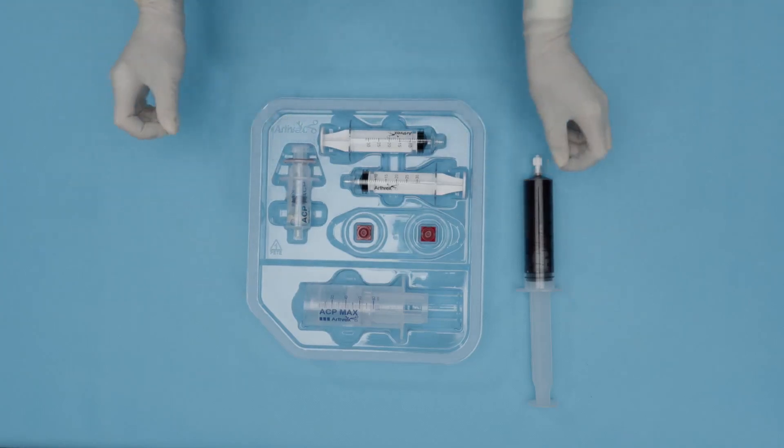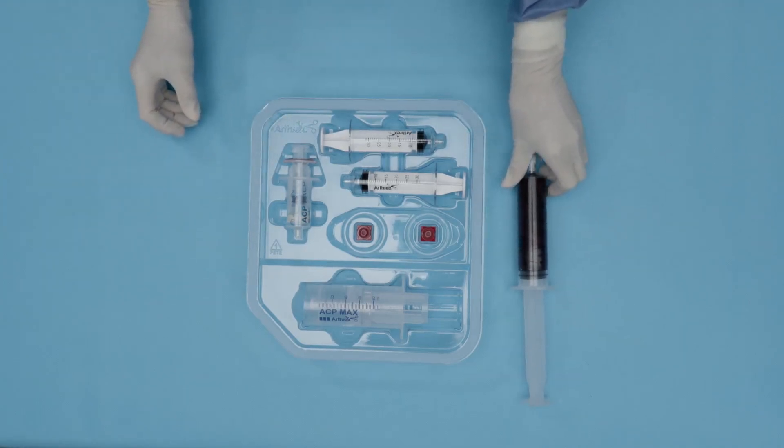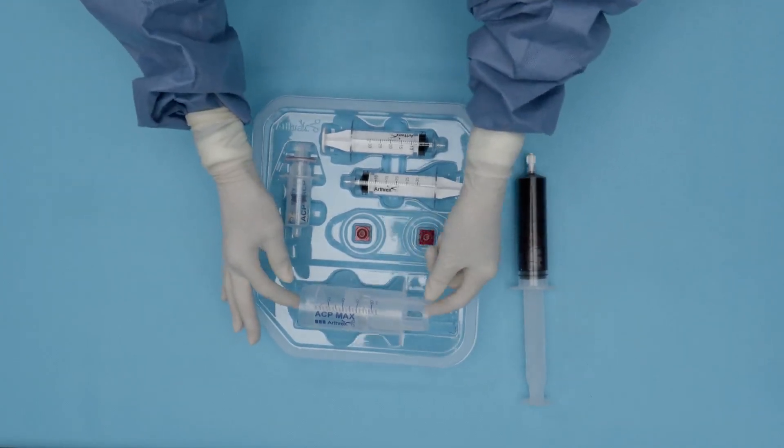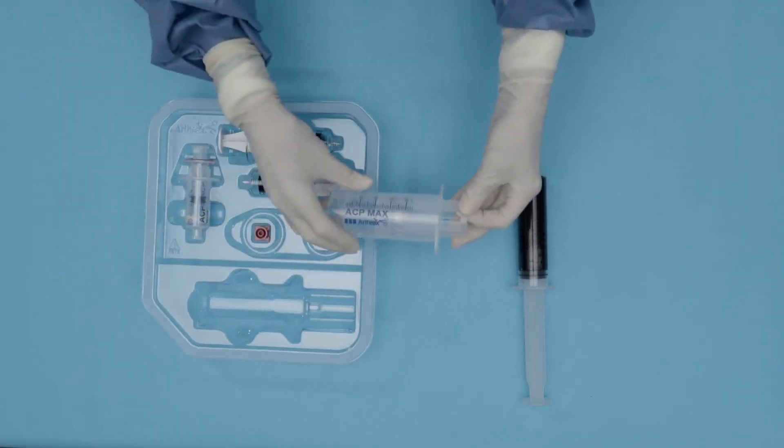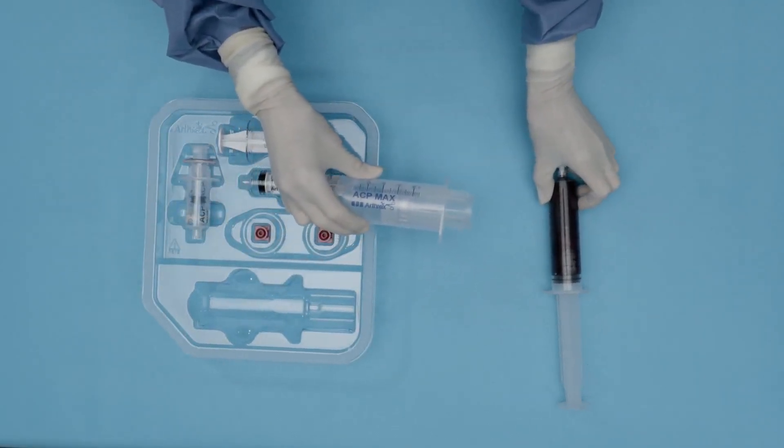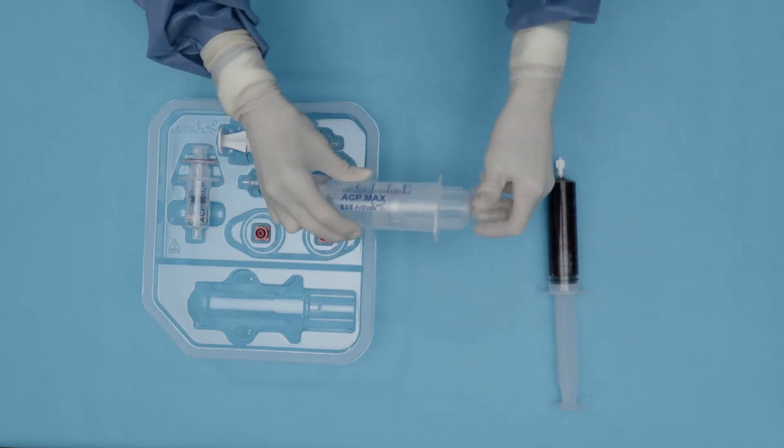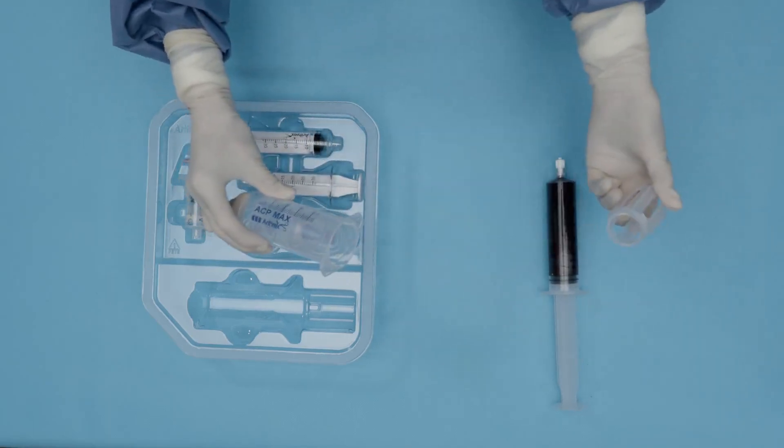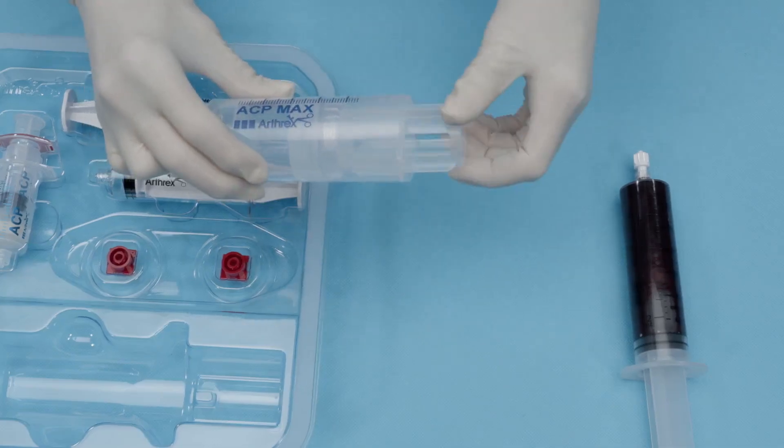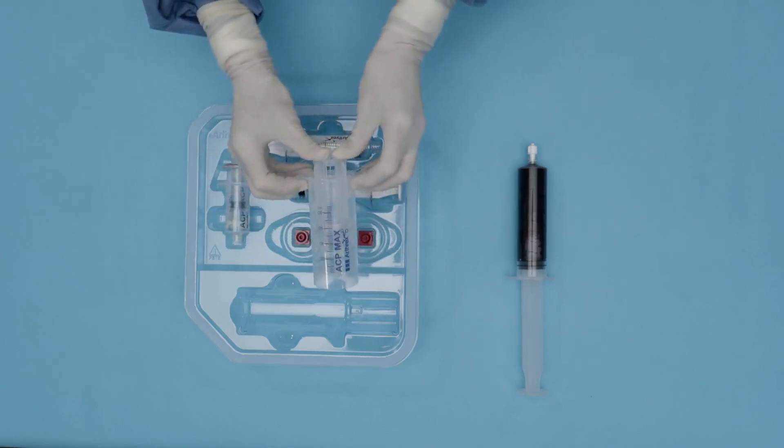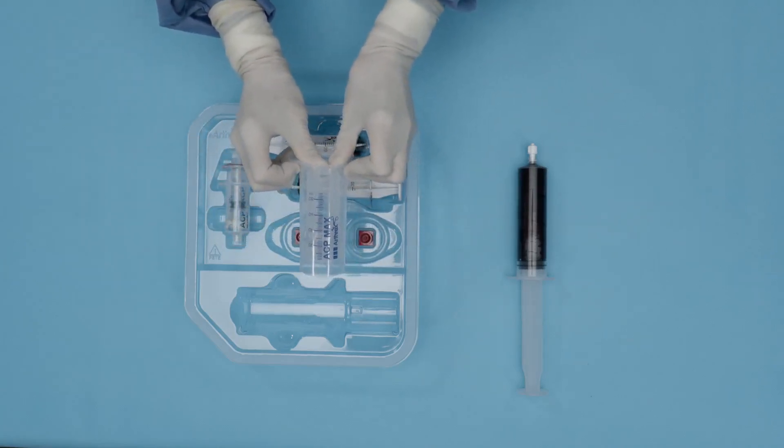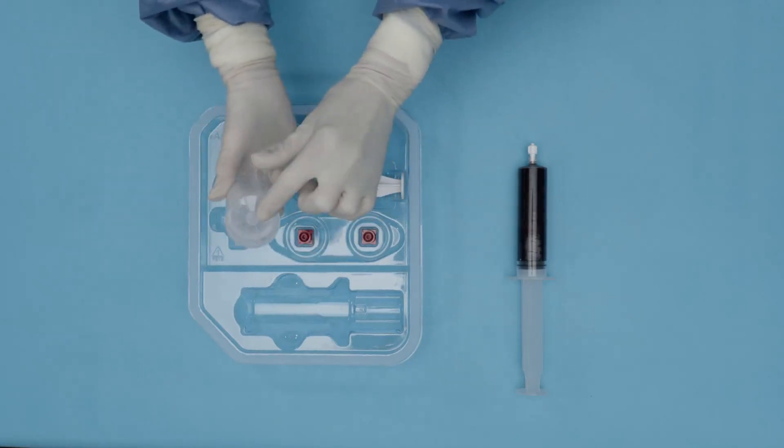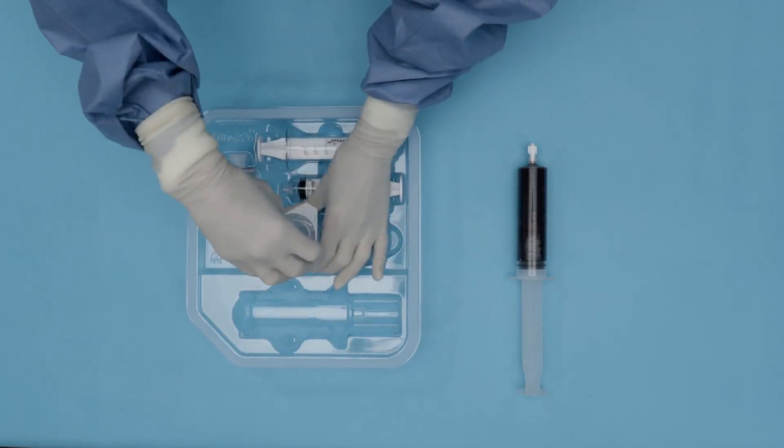When you're ready to process your peripheral blood, you're going to remove your ACP Max device. If you're processing a total of 60 cc's of blood, you don't need the cage guide. It can be removed. If you're processing 30 cc's of peripheral blood, you will use the cage guide. You want to start by removing the air from the ACP Max device. Then you're going to place the lure cap onto the bottom of the ACP Max device.